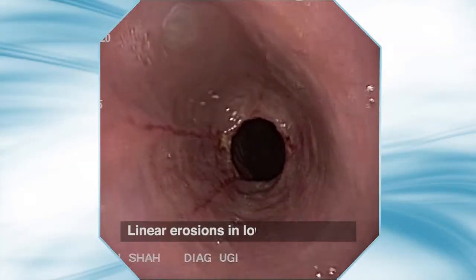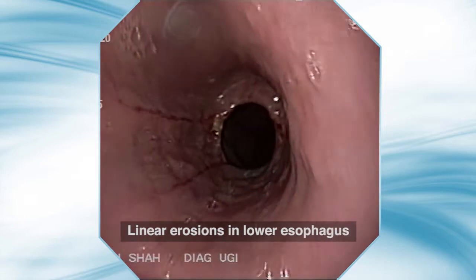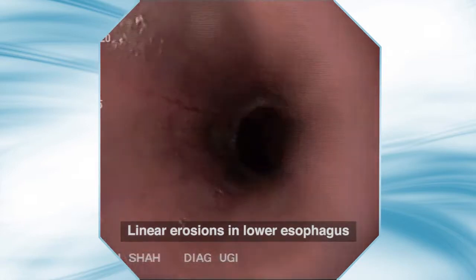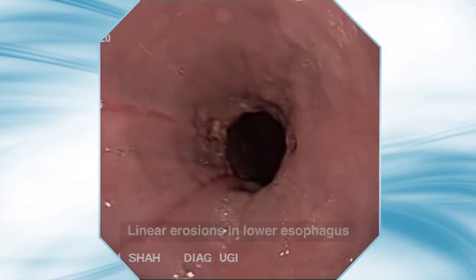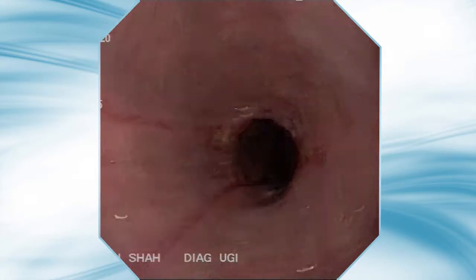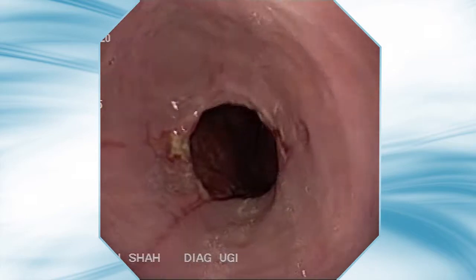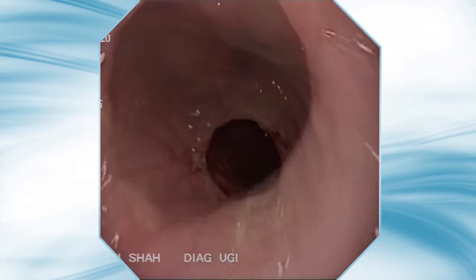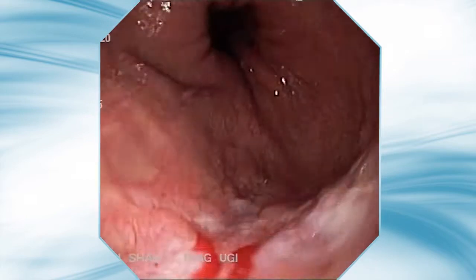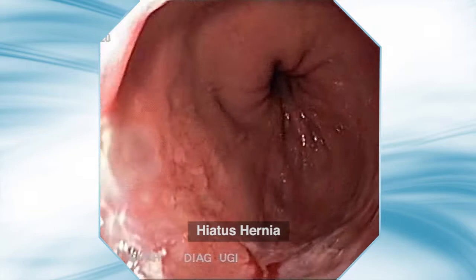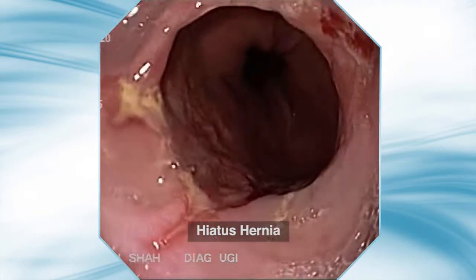Another case showing long linear erosions with narrowing of the esophageal lumen. A significant hiatal hernia is visible.